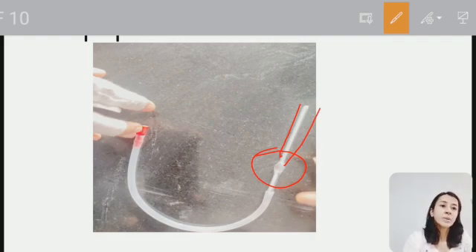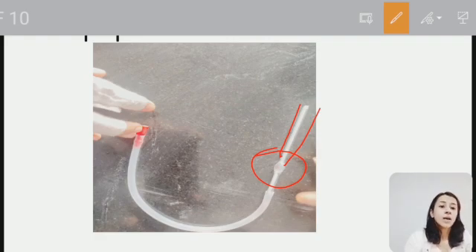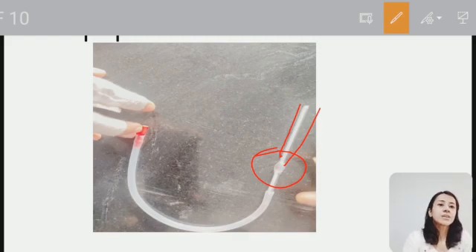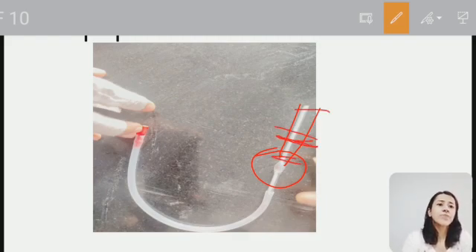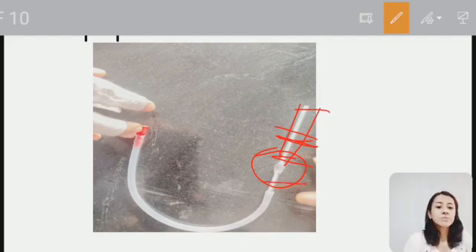The markings on the RBC pipette are 0.5, 1, and 101. The use of the RBC pipette is similar - to dilute the blood with RBC diluting fluid.